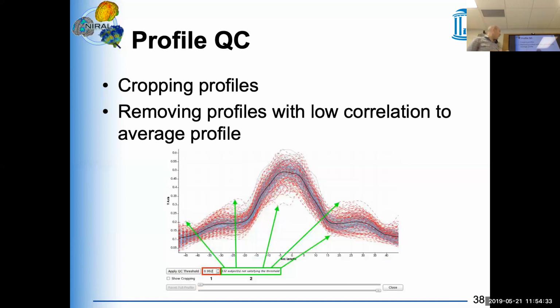And often, depending on the tract, in infant studies it can go all the way down to 0.7 or so. That also means, for example, in our IBIS study, that it very quickly goes down. Now, in our IBIS study, it also goes down very quickly because we have a crappy diffusion sequence with low SNR.